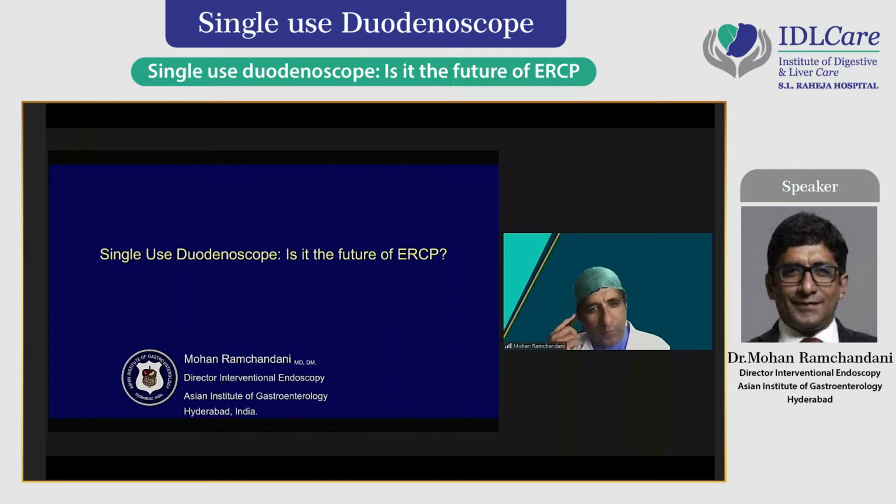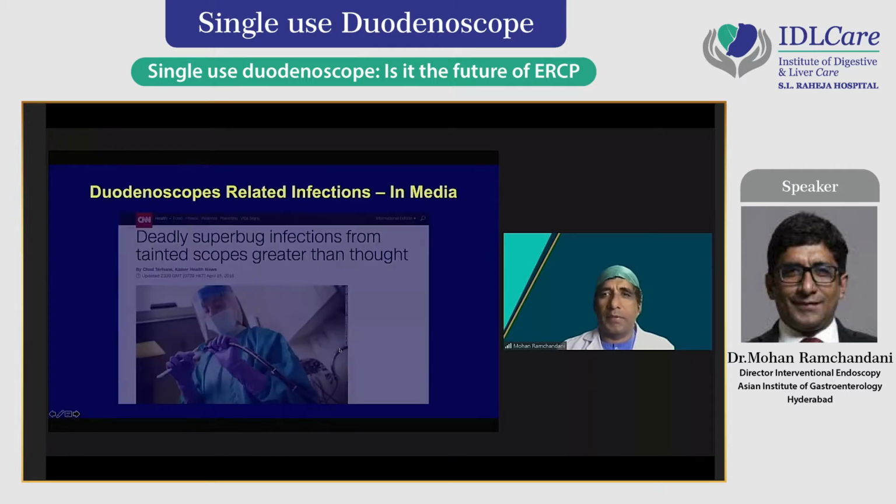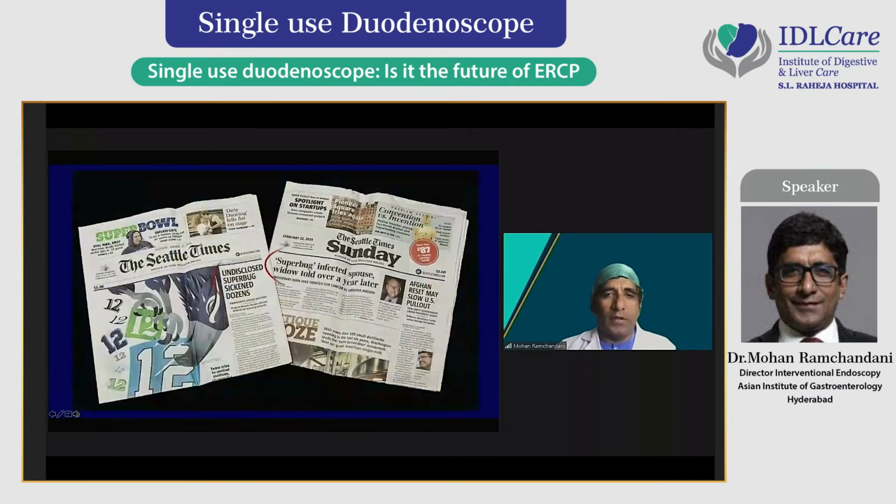I think, as you rightly told, this is the new kid on the block, the single-use duodenoscope, which is a very exciting topic. And as we all know, in 2015-16, the thing started appearing in media that people who are even not knowing what ERCP has quickly recognize that there is a super bug which is causing deadly infections and is being transmitted by a tainted scope. And this kept on appearing in the main newspapers.